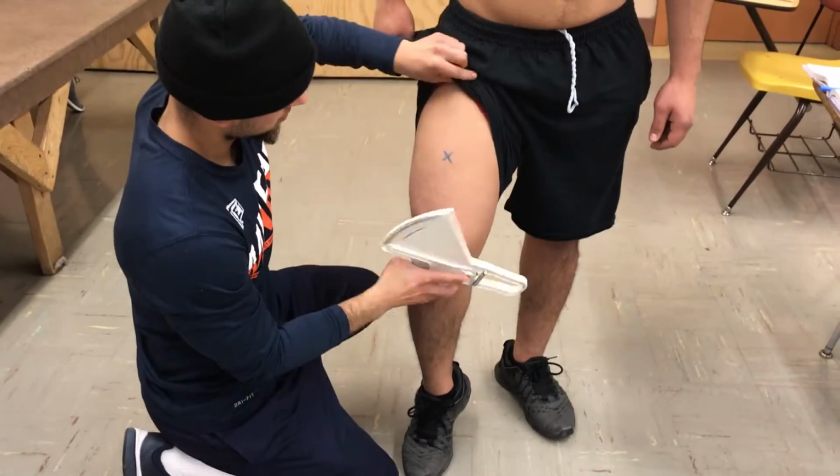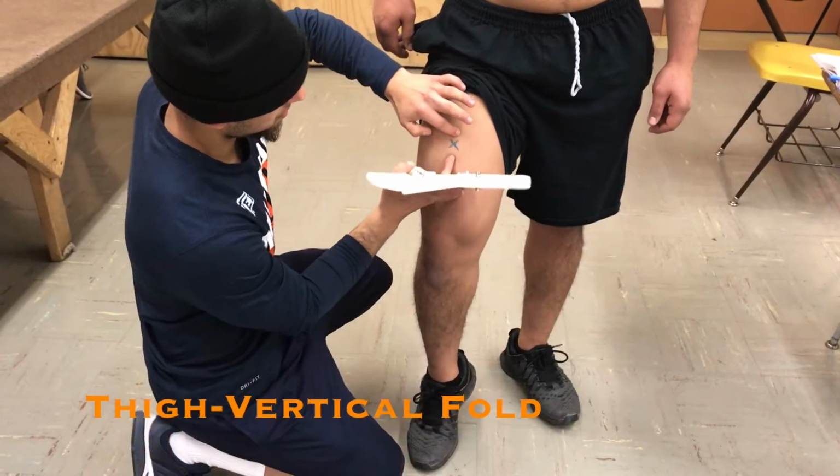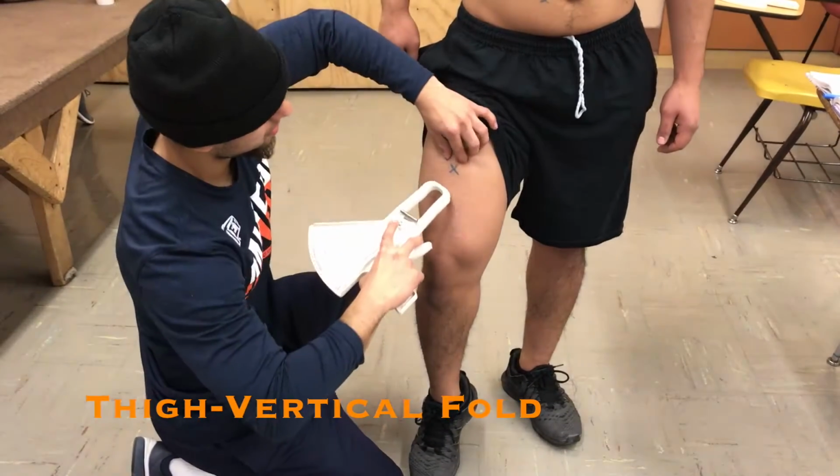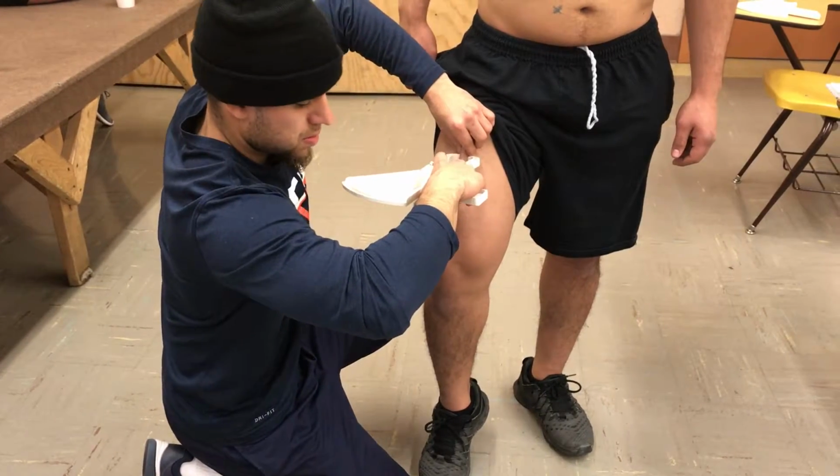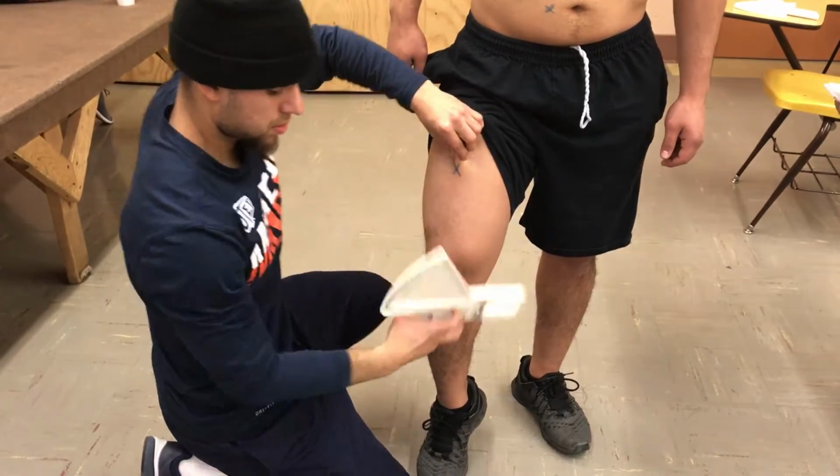The 7th and final site will be the thigh. The site should be marked on the anterior midline of the thigh, midway between the proximal border of the patella and the inguinal crease. It is a vertical fold. Obtain the reading, then release after 1 to 2 seconds.